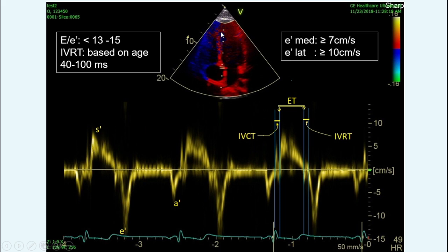With ending systole and starting diastole, the base of the heart suddenly drops down and goes away from the apex or transducer, so it gives us the first negative Doppler shift. We call it E prime, and it corresponds with E at the mitral valve inflow or rapid filling.